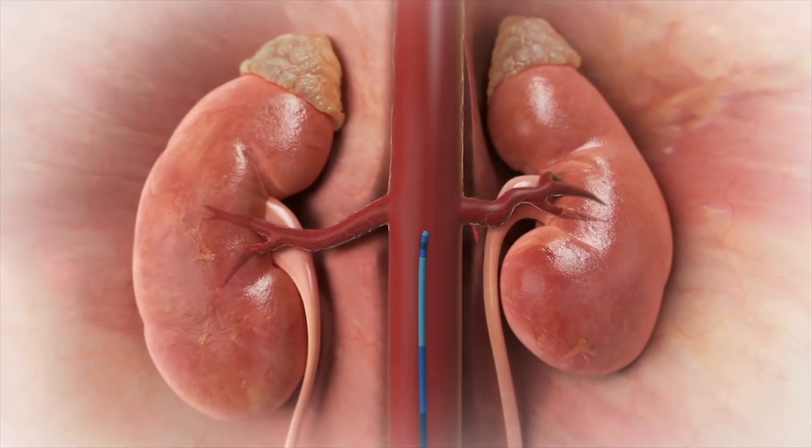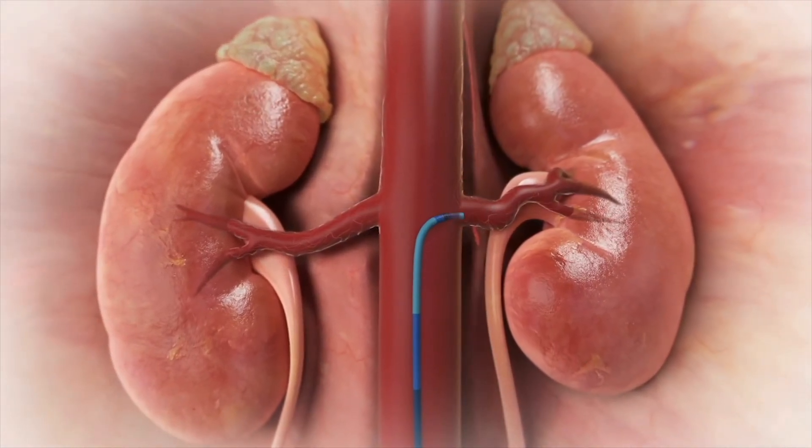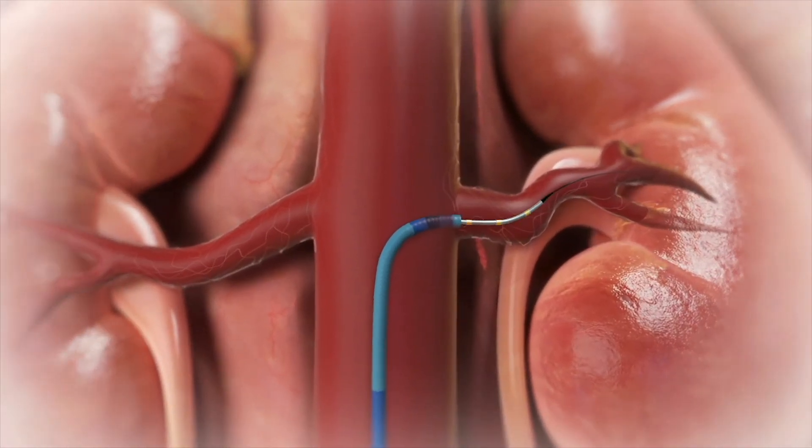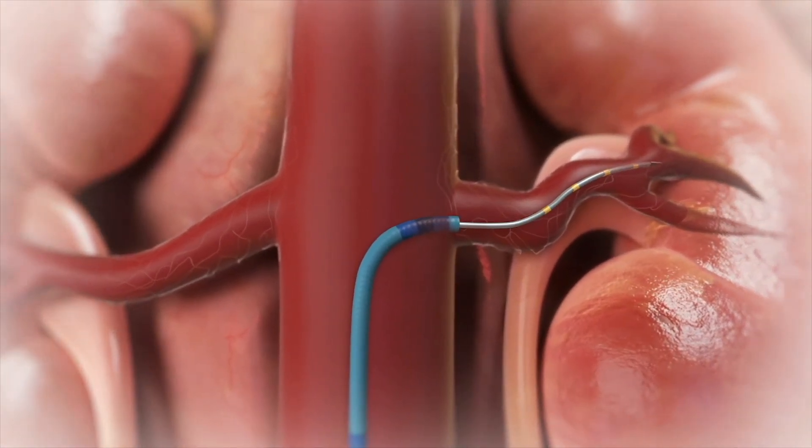After a single 60-second ablation, the Simplicity Spiral catheter is repositioned into the contralateral renal artery and the ablation procedure is repeated.